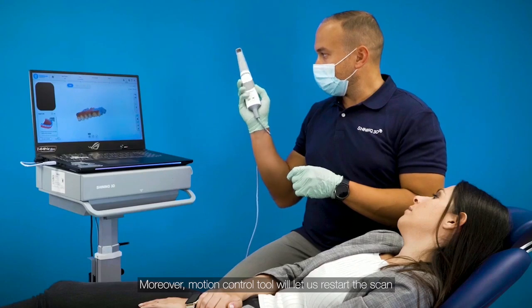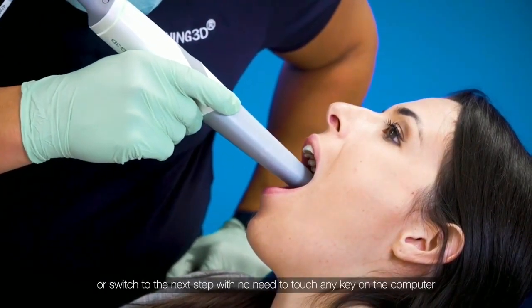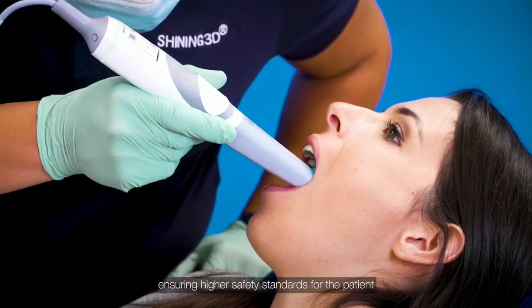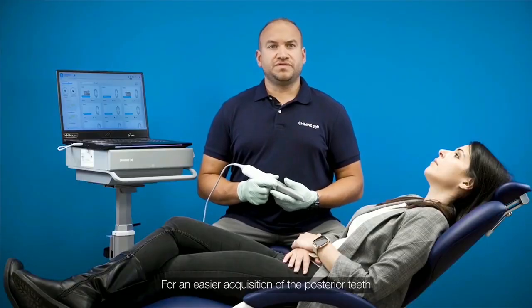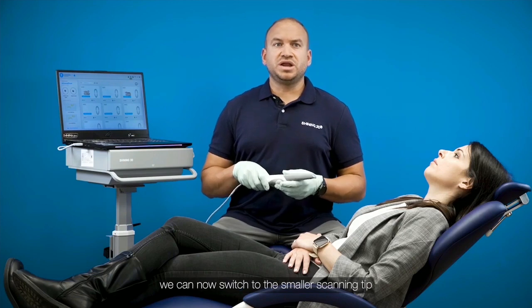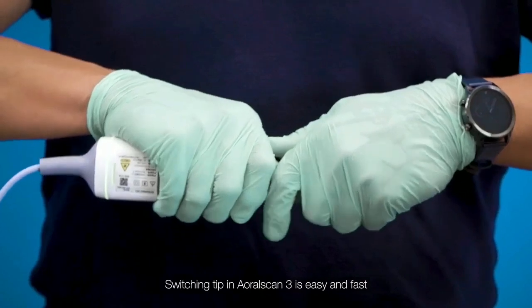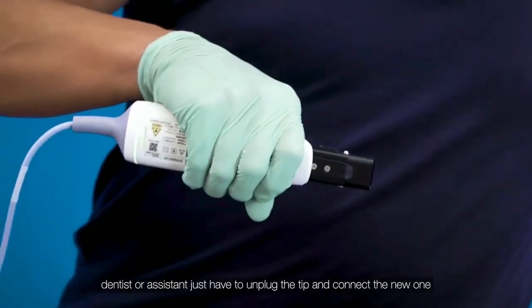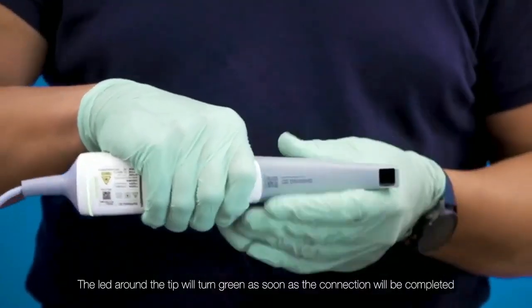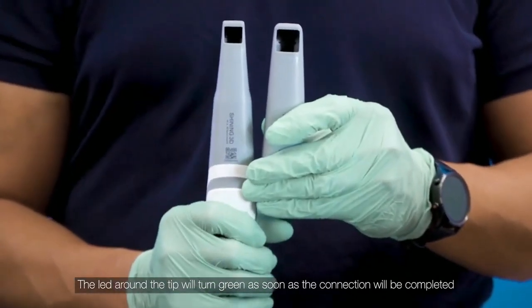Moreover, motion control tool will let us restart the scan or switch to the next step, with no need to touch any key on the computer, ensuring higher safety standards for the patient. For an easier acquisition of the posterior teeth and to ensure more comfort for the patient, we can now switch to the smaller scanning tip. Switching tip in Aoralscan 3 is easy and fast. Dentist or assistant just have to unplug the tip and connect the new one. The LED around the tip will turn green as soon as the connection is completed.